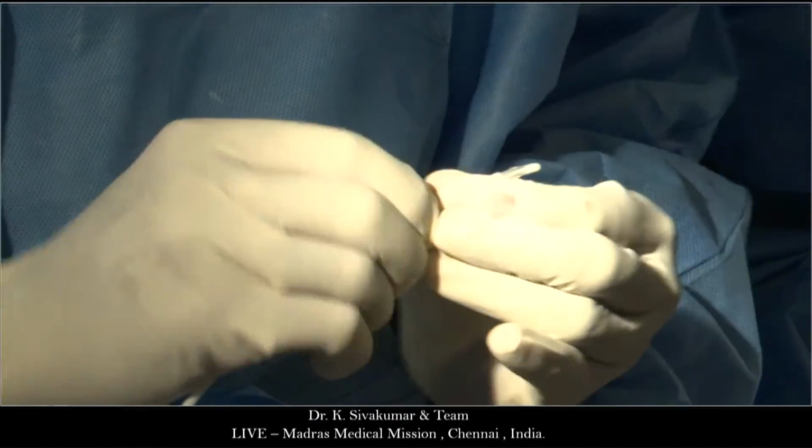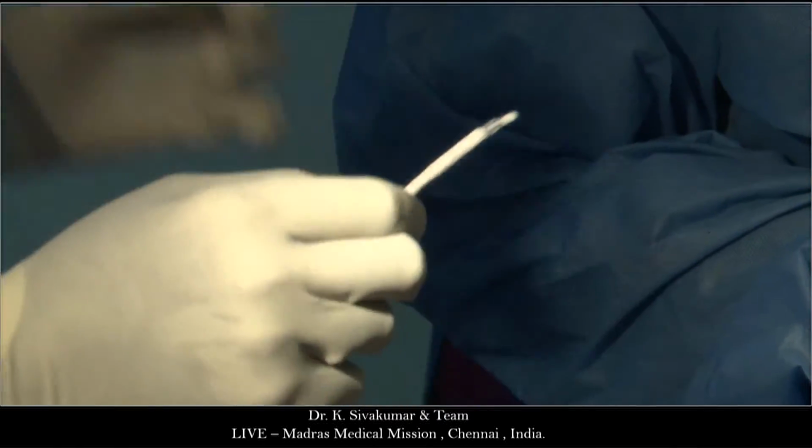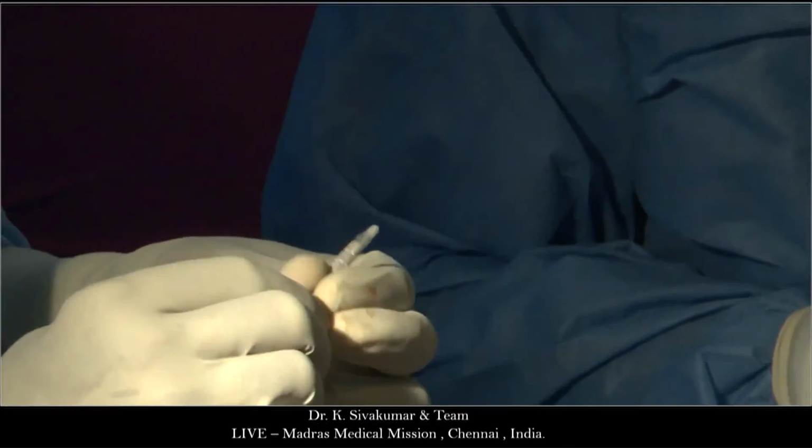Use a bigger sheet. Shiva, how's the covering on the stent? Is it glued on or stitched on or embedded? No, it is totally welded.